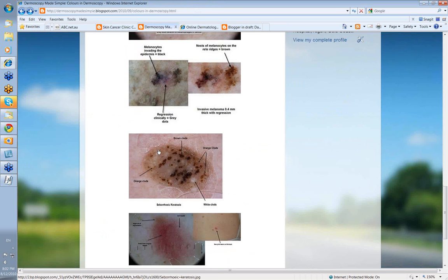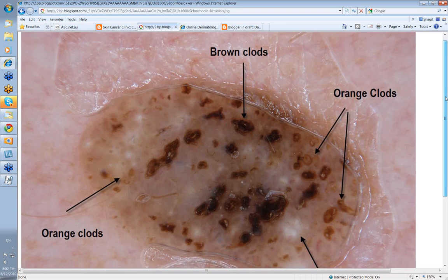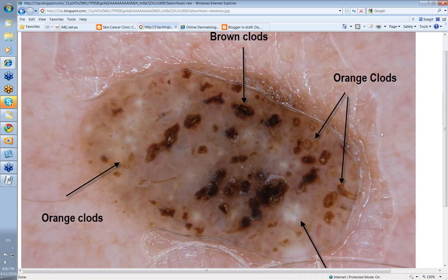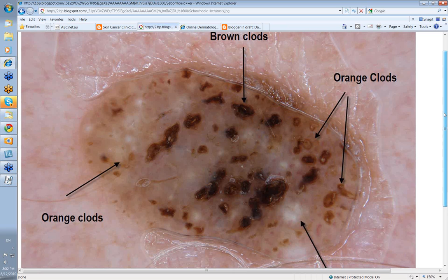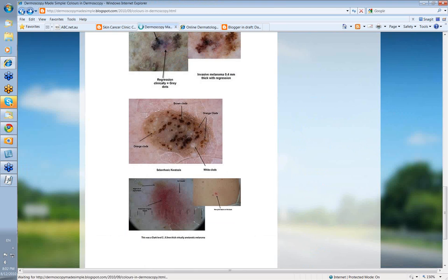What about some of those other colors — yellow and orange? This lesion is a seborrheic keratosis. You can see what we call orange clods, very typical of seborrheic keratosis. There are some brown clods as well, and these white clods — these were milia or milia-like cysts, retained keratin high up in the epidermis. So these are some of the colors you can see in a seborrheic keratosis: yellows, orange, and sometimes white milia.